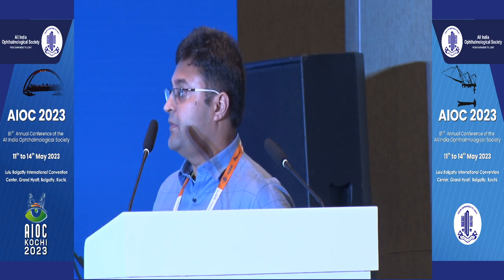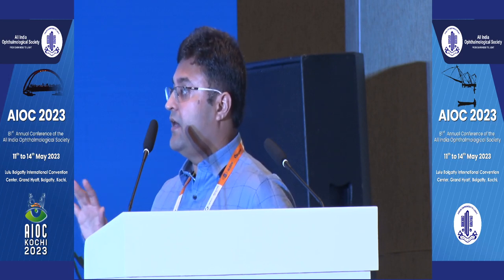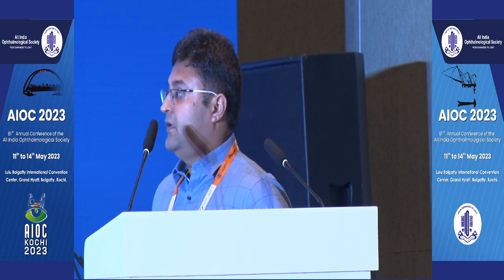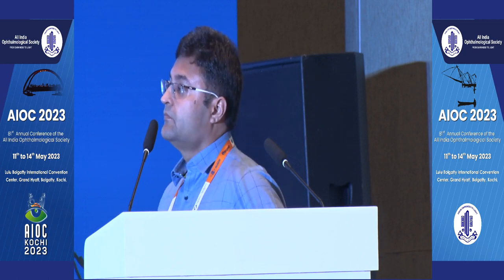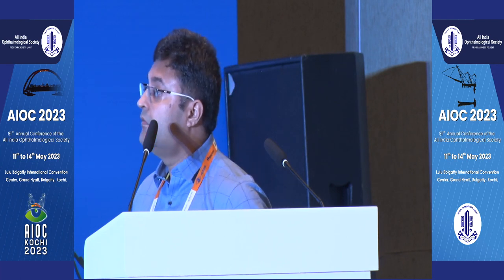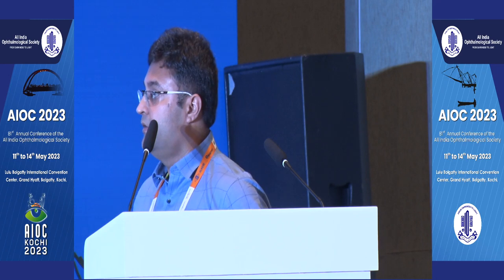It's just the place where it has gone through that is going to form a clot, and the circulation is going to get reestablished. I've had a case, I've not put a video of that, where I had a bleed. I just sat on it, closing the ports for about 5 minutes, and it stayed well. Once I went in, I could see the clot on the artery and the bleeding had stopped completely. Like how you do in diabetics typically. And how low do you take the pressure? Pardon? How hypotonous do you make it? It should be around 5 millimeters of mercury, if you ask me.